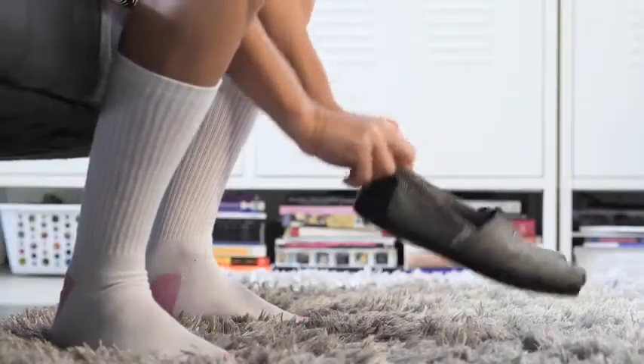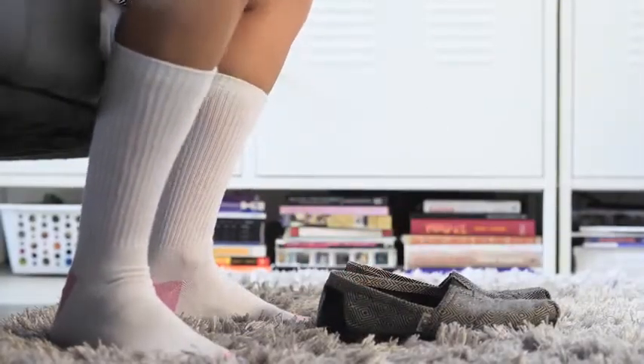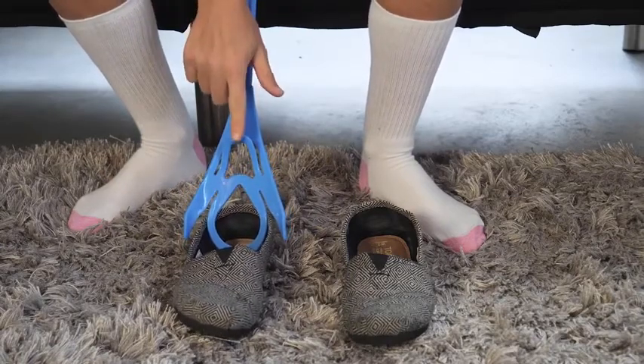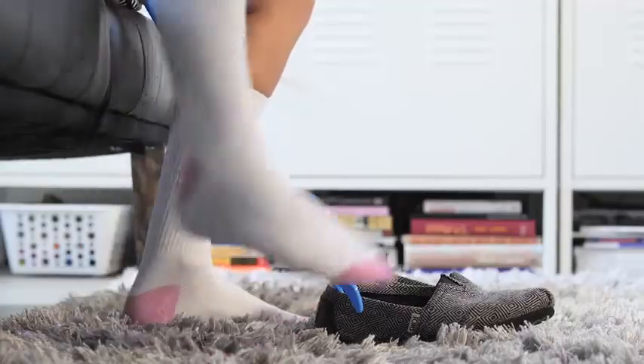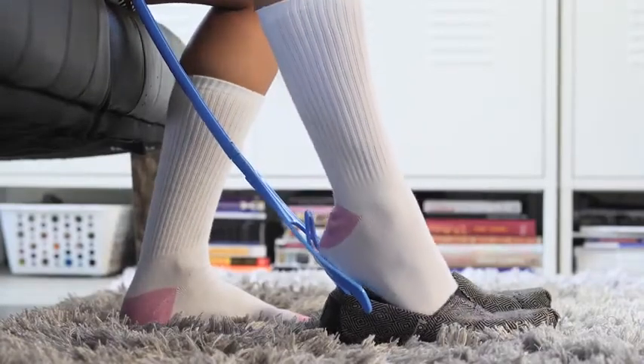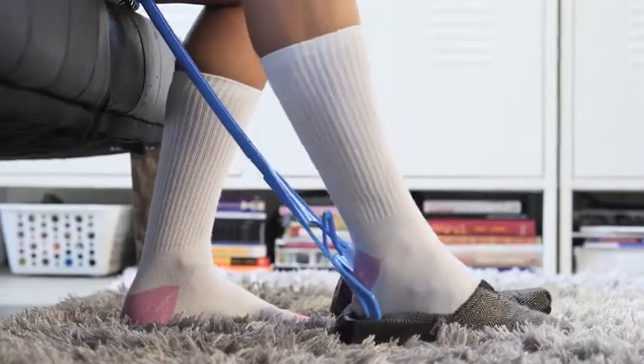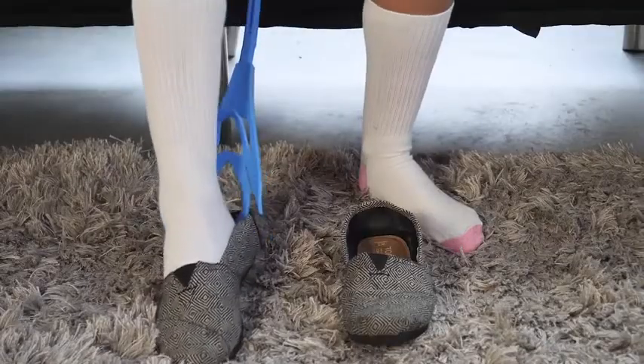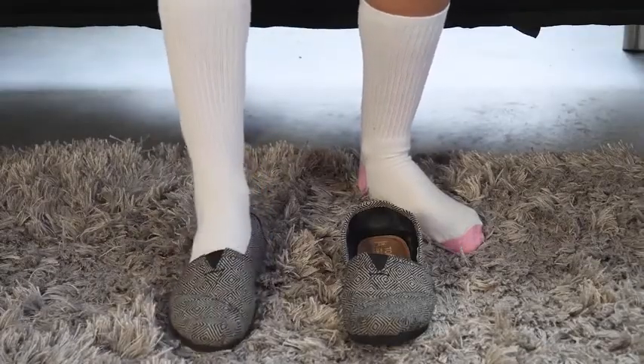When using the Sock Slider system handle as a shoe horn, place your shoe on the floor in front of your foot and untie any laces or unstrap any buckles on the shoe before preparing to use the system. Stabilize your shoe with the handle and slowly insert your foot until it is fully inside your shoe. Tie laces or secure buckles before getting up.